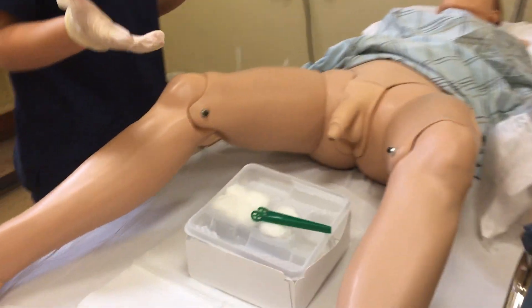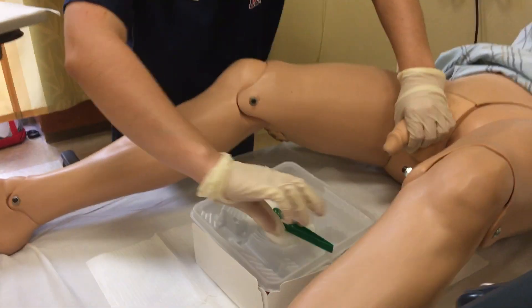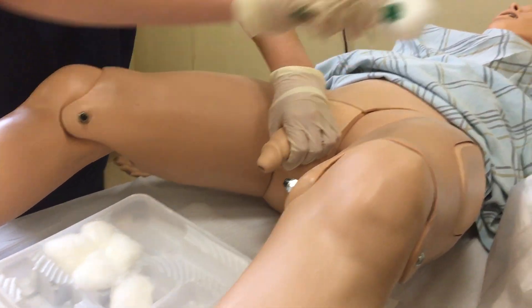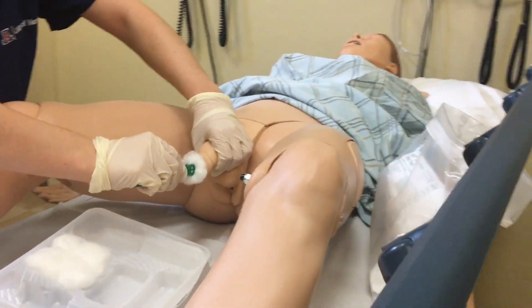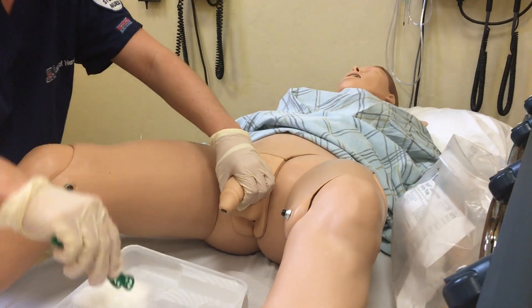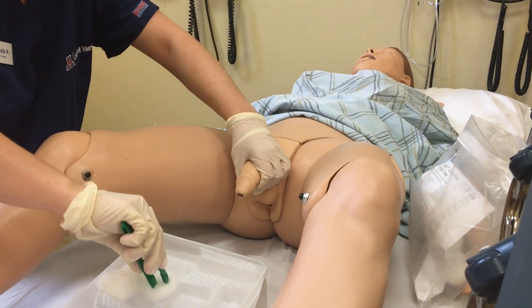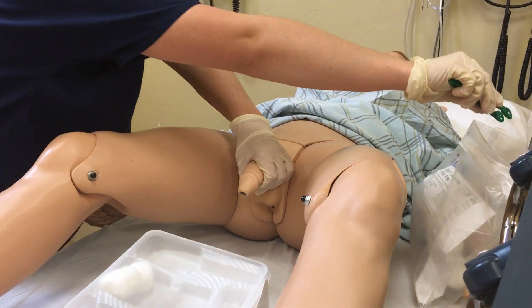Now I'm going to move my equipment over to my sterile field. I'm going to begin the cleaning process — you're going to feel my hand on your penis and it may be a little cold. Using every cotton ball I have in my kit, I'm going to clean starting with the tip and using a circular motion outwards. I'm also going to make sure that my forceps and my dominant hand do not touch the patient.